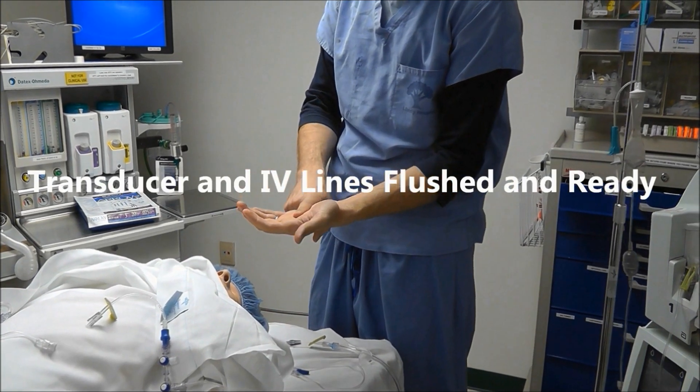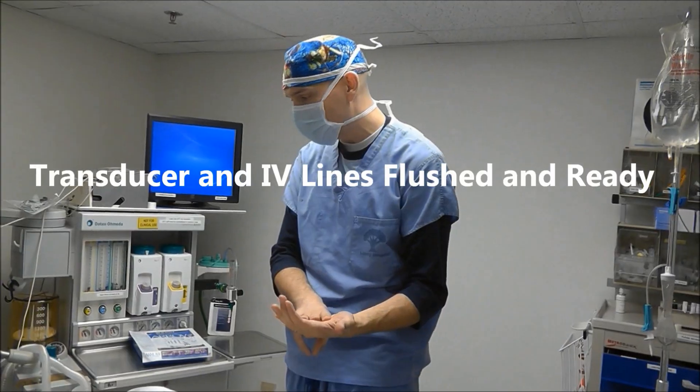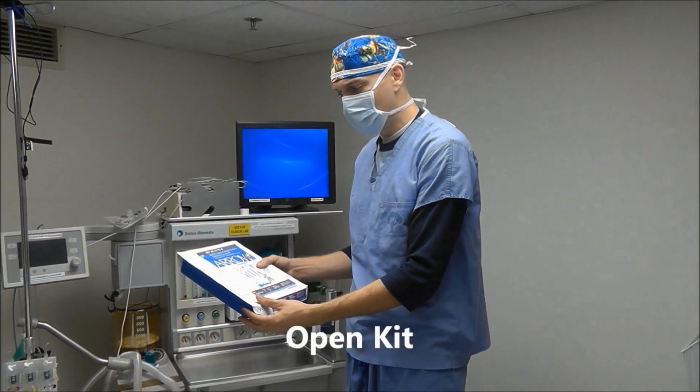So you have your transducers, your infusions, and your extra IV bag ready. Then the next thing we're going to do is open our kit here.